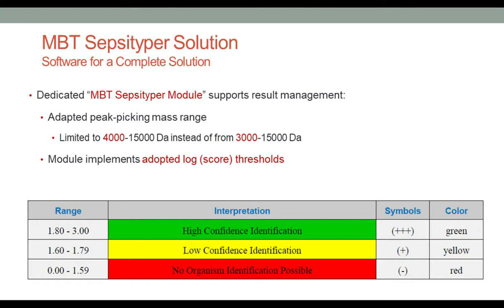Our next question is, what was the adjustment that your molecular specialist recommended that resulted in more successful testing? I think I already answered that question, but it's just the method that we used to pull the supernatant off, making sure we weren't disturbing the pellet.